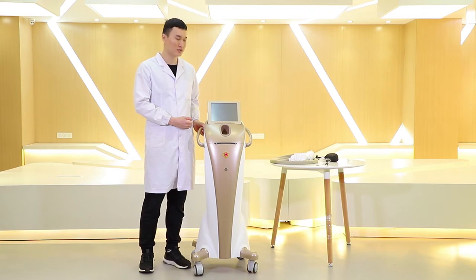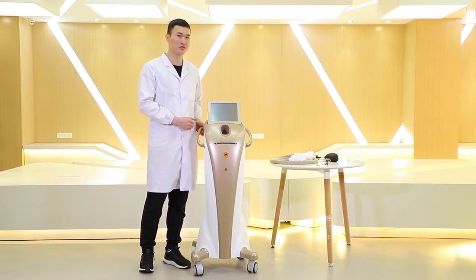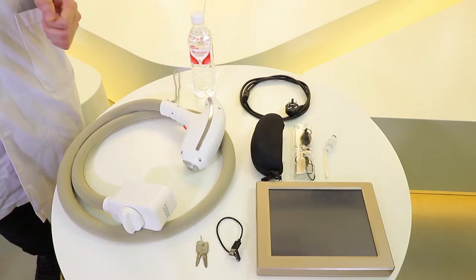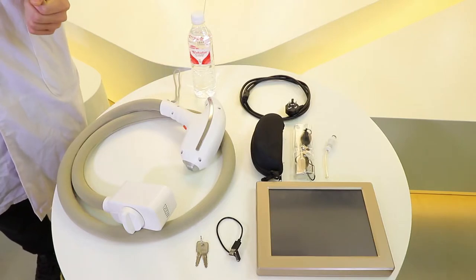Now we are going to introduce how to install this machine and go over the spare parts.